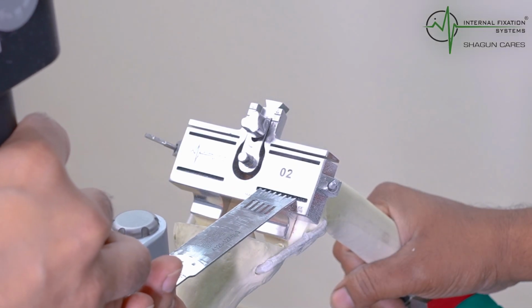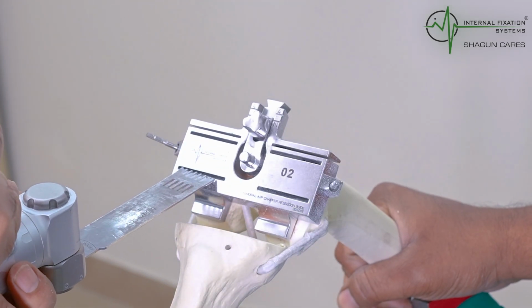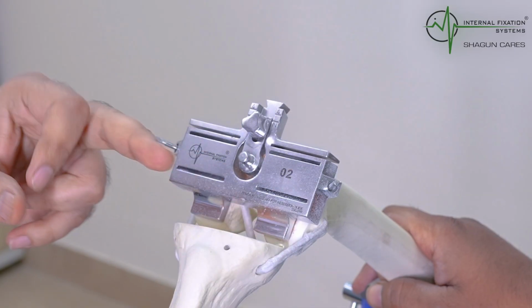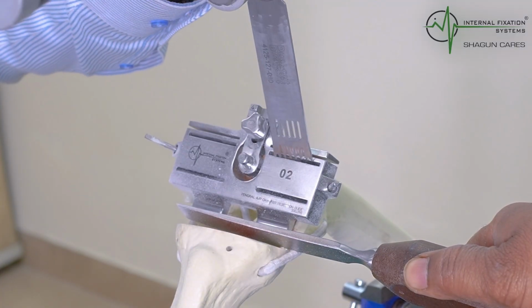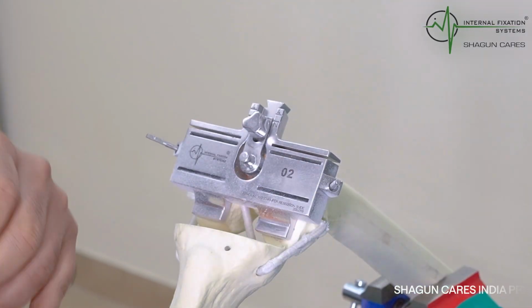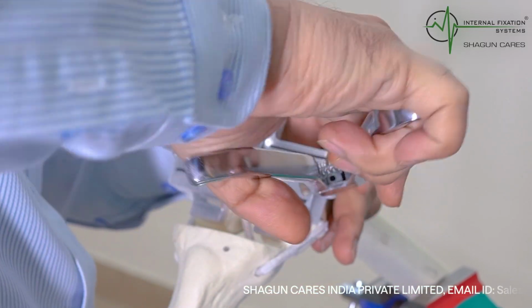Now we are going to take the chamfer cut. We need to protect the posterior part. Protect this, and then you take the posterior cut. Now we remove all the set here.